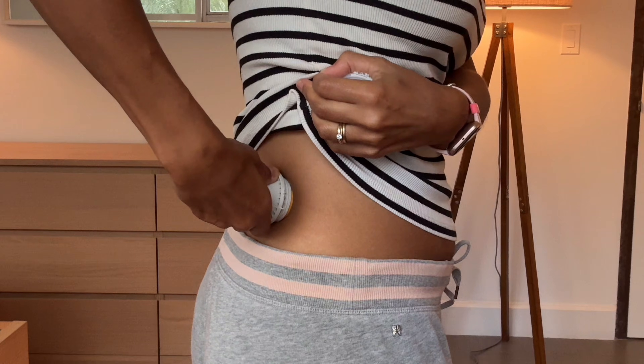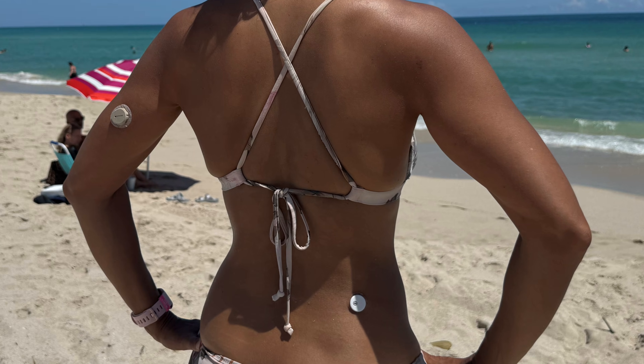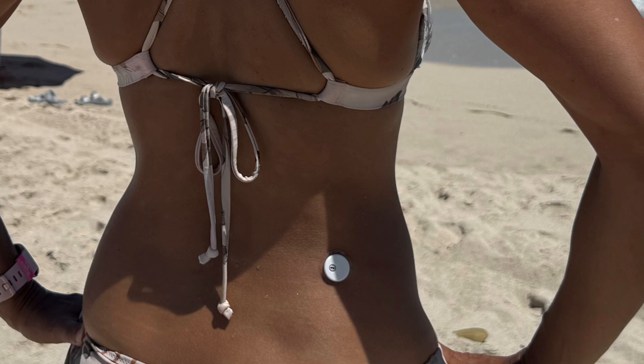My favorite placement is right here on my lower back. Honestly I didn't expect it to work this well — it kind of surprised me. I've worn other CGMs in this placement before, but it's been a while, and this experiment reminded me of just how great a placement it is. What I really like is that it's out of the way — how often do you bump your lower back on something? I also usually don't inject insulin in that area, so it's not taking away an injection site. It also stuck extremely well to my skin despite a lot of warm weather and dips in the ocean.